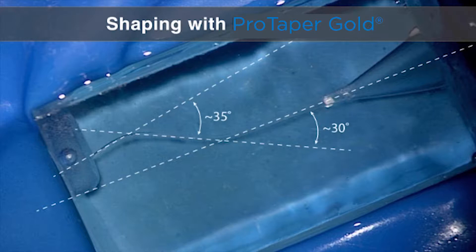Normally, we would clinically use a viscous chelator as we begin our glide path procedures, but in plastic we'll just use 70% isopropyl alcohol. Notice the access is done and we'll just use the straight international most-utilized files: purple, white, yellow, red. That means we won't use SX in this case, but we would clinically if it was a lot longer block — that would really help us achieve length. So just use the S1, the S2, and then two finishers, F1 and F2.